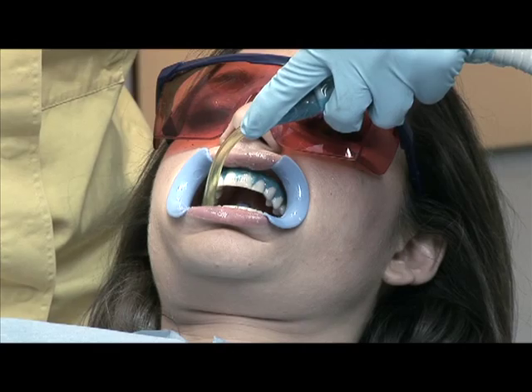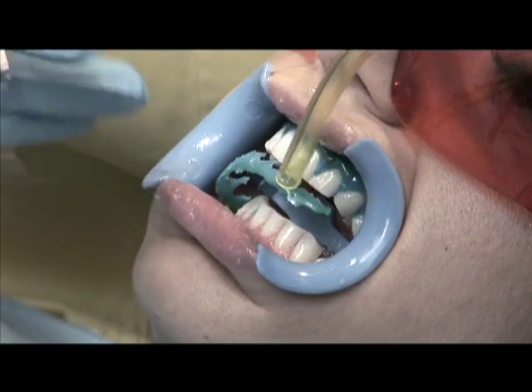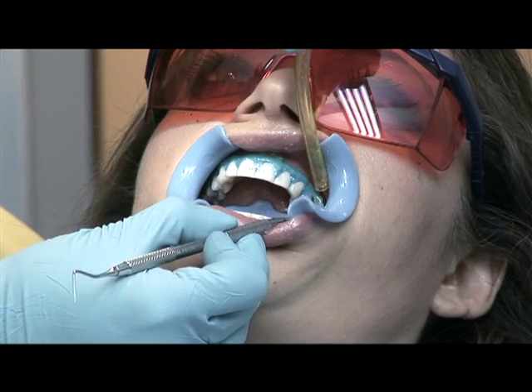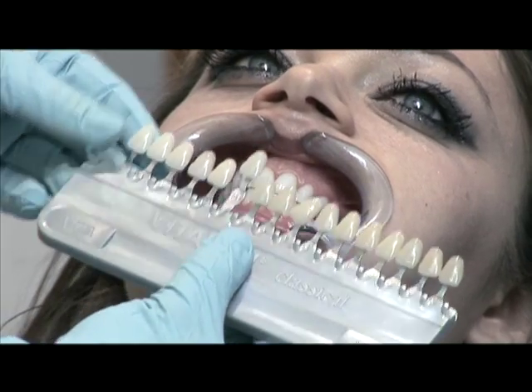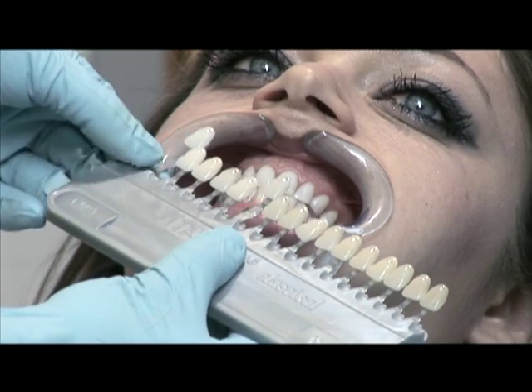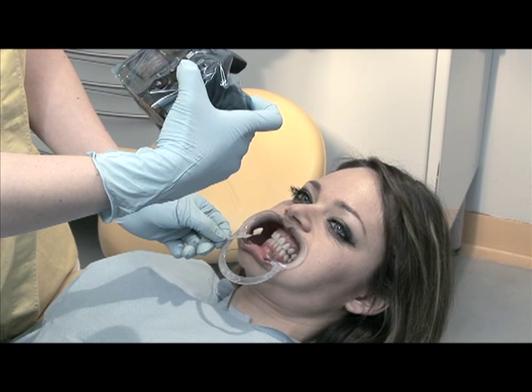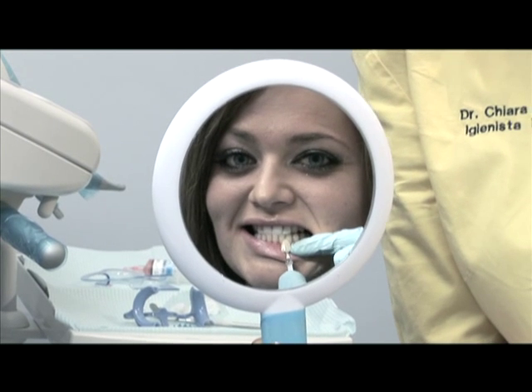At the end of the treatment, use a probe to remove the gum shield, making sure not to injure the surface of the soft tissues. The Blanc 1 protection can be easily removed. Use the saliva aspirator to pick up the pieces of the dam. After the patient has thoroughly rinsed, take photographs of the clinical case and check the final colour of the whitening treatment together with the patient. Show the results to the patient right away, using the shade guide directly in the mouth to compare the initial colour to the final one.